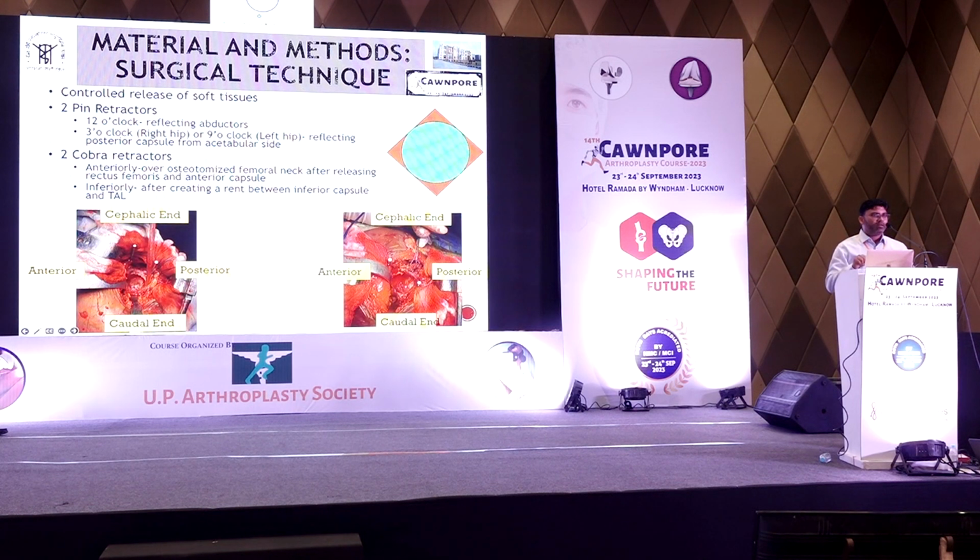If you put a pin, you are dead sure that you are not going to retract beyond a certain limit. Also, there is a cushion of posterior capsule and short external rotators between the edge of the acetabulum, the pin and the sciatic nerve. So that protects your sciatic nerve.